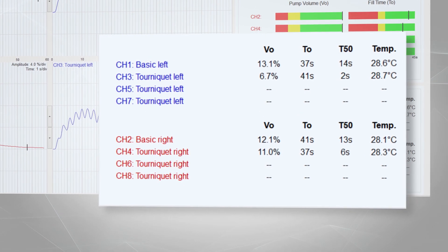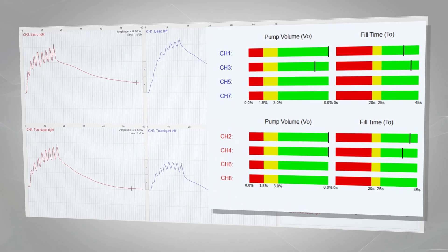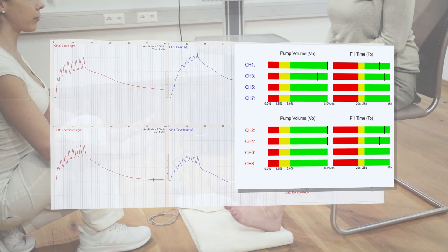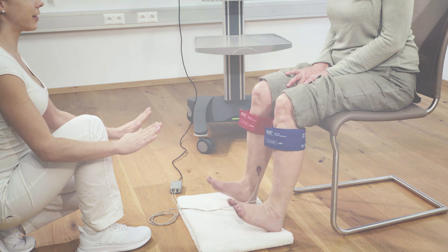Additional sensors on both probes detect and compare the skin temperature of the patient during the measurement. The results are displayed in a clear color scale. Optionally, another measurement can now be recorded with a tourniquet cuff attached.